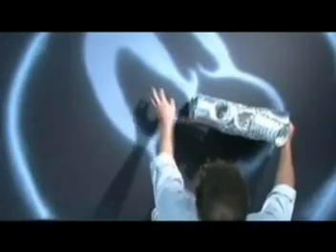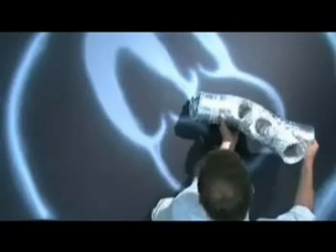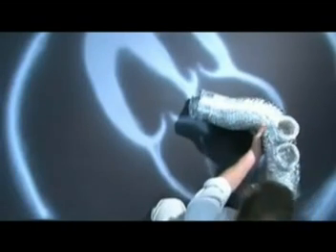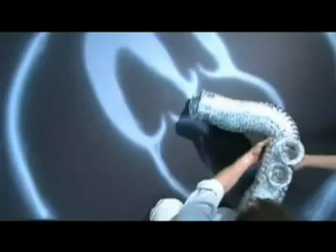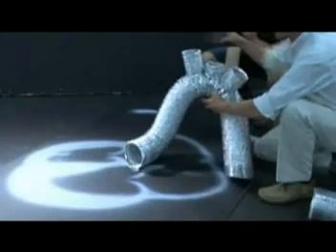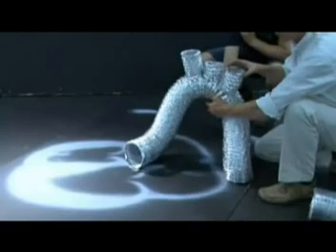So the aorta is a tube that comes out of the left ventricle just above the atrioventricular septum. It comes out horizontally at first across the chest towards the right side of the chest, turns the corner and then starts to go down, having given off the head and neck vessels, and ends up going down the descending aorta down here.